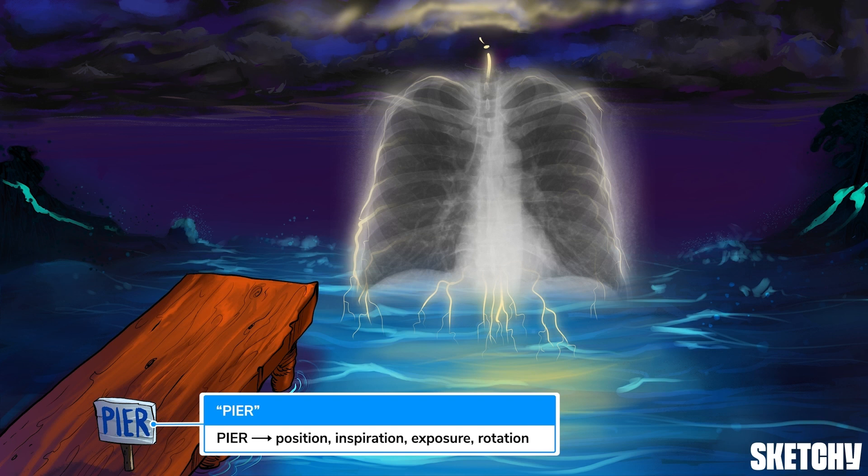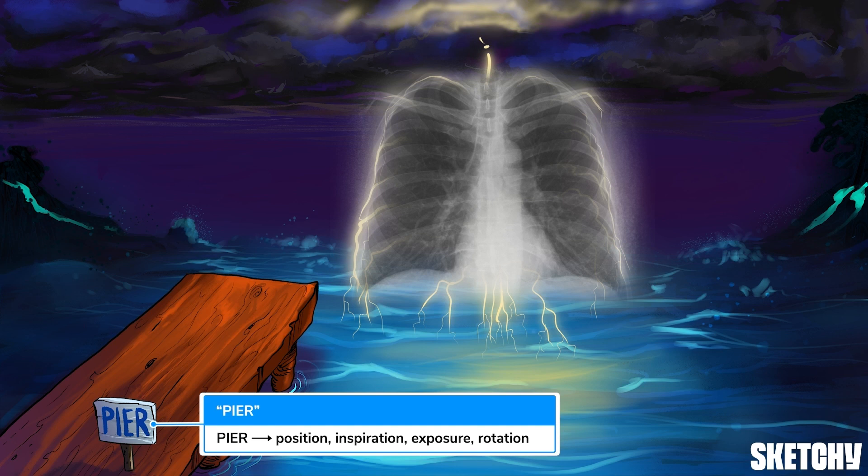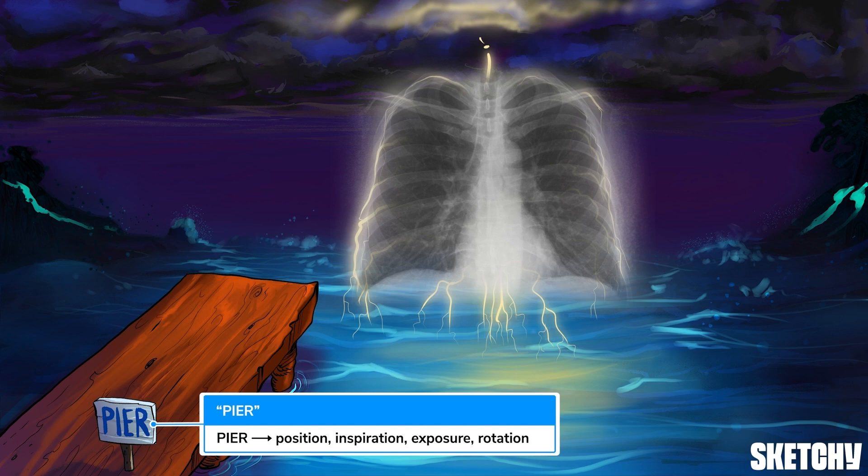Position refers to the position from which the x-ray was taken. Are you looking at a supine AP, or PA view, or perhaps a lateral view? A PA film, which is taken with a patient in the upright position, has far superior image quality to a supine AP, which is mostly reserved for patients who can't get out of bed.